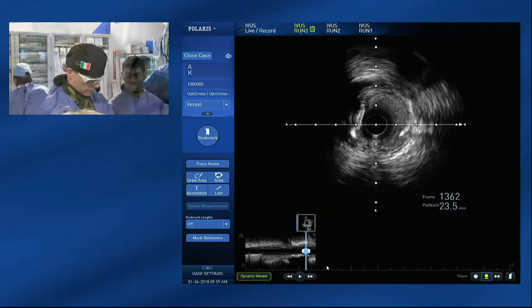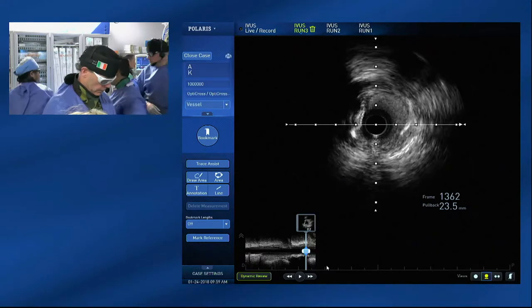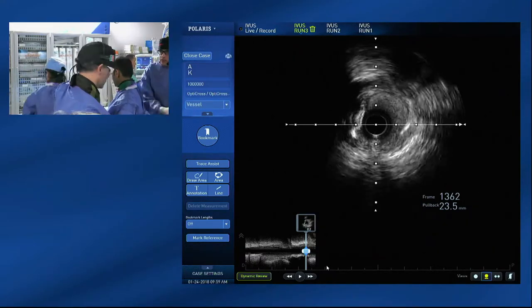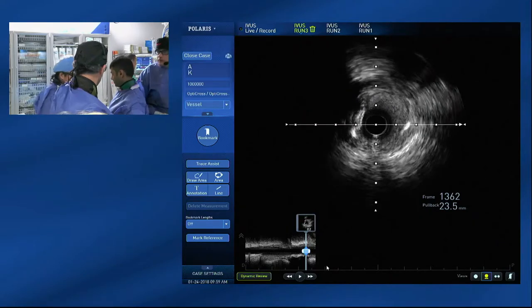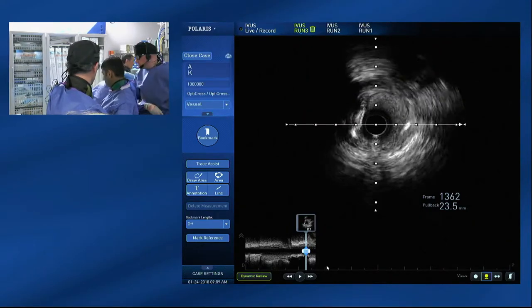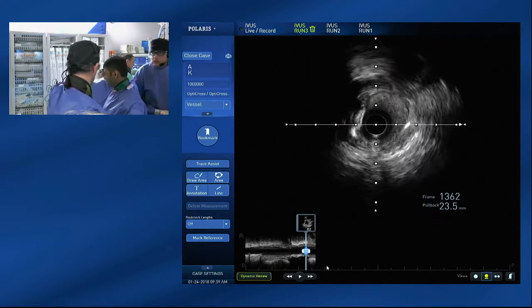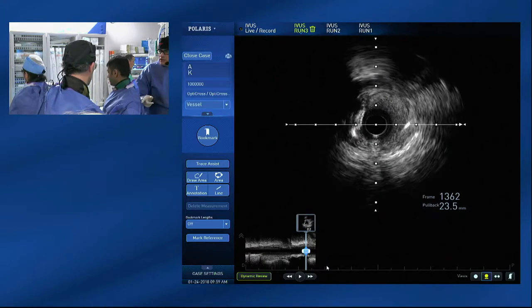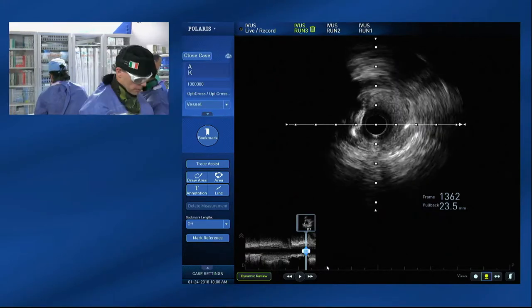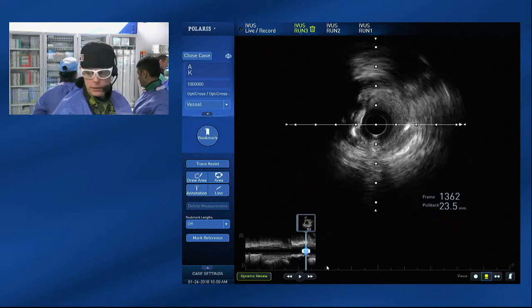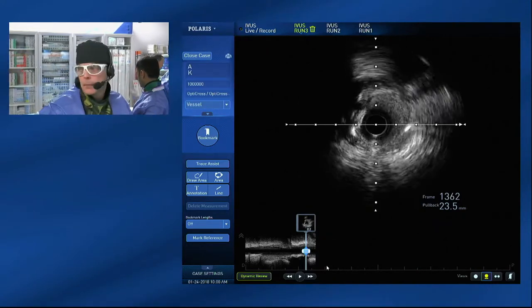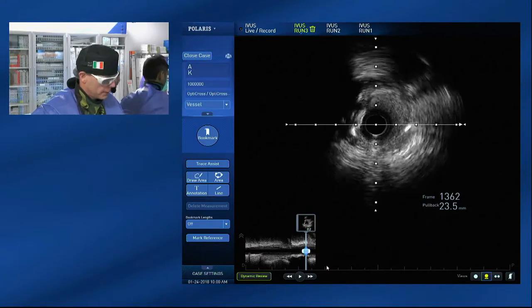The sub-intimal space is your friend — it's the gap between two lumens. Showing that your retrograde wire is sub-intimal, and from the appearance of the antegrade wire it would appear to be sub-intimal as well, means you're in a good spot because it's easier to connect the spaces when both wires are in the same space. Let's see you live — let's see what's happening.